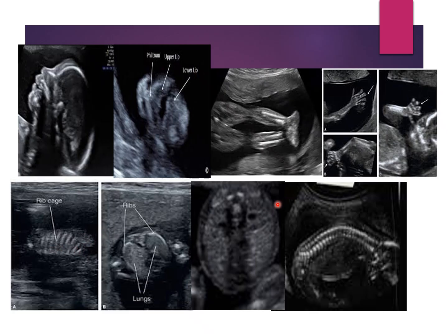The spine, we generally image one longitudinal view from the cervical spine all the way down to the sacrum, just to show that the skin surface isn't broken here. And then we do a more detailed view in transverse from the cervical spine all the way down to that sacrum.